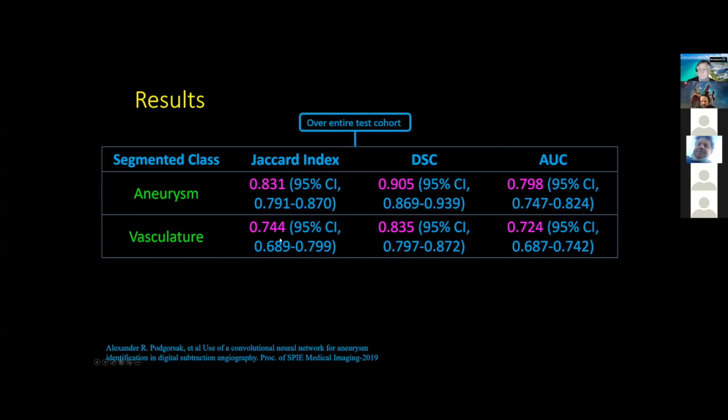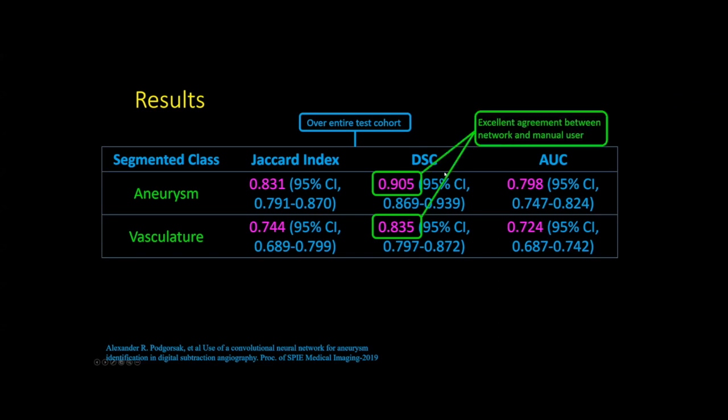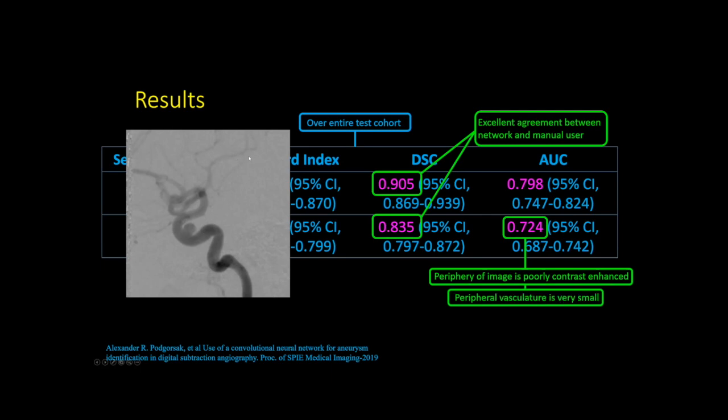For vasculature, in here, it is on the bottom. What we're focusing in general, it is over these values, dissimilarity coefficient, similarity coefficient, which is really good. We like it. However, for the area under the curve for the vessels, it is a problem because it's trying to segment this low signal data in here, and it's poorly enhanced. But again, we do not care when we look for lesions. We do not care about this artery in there.